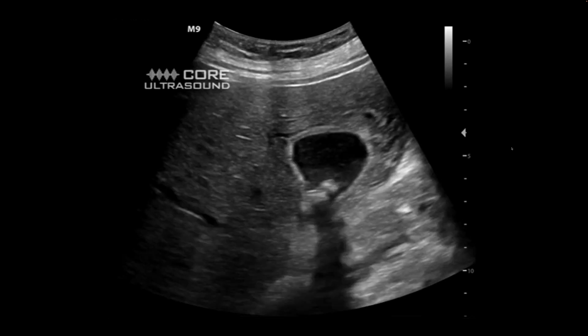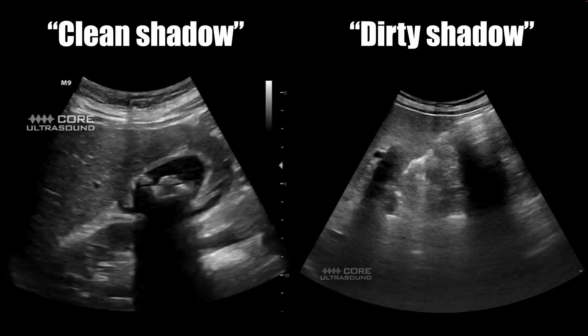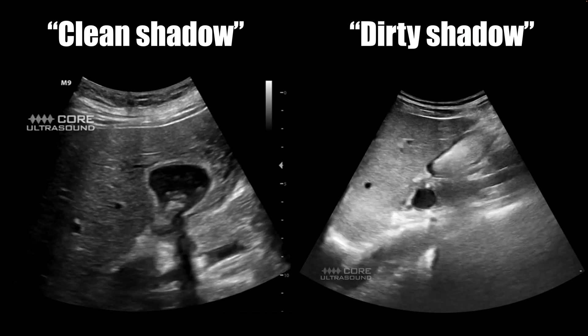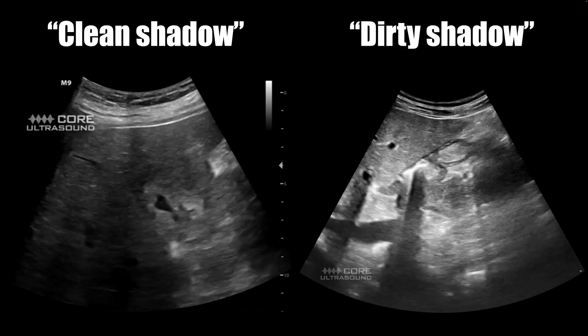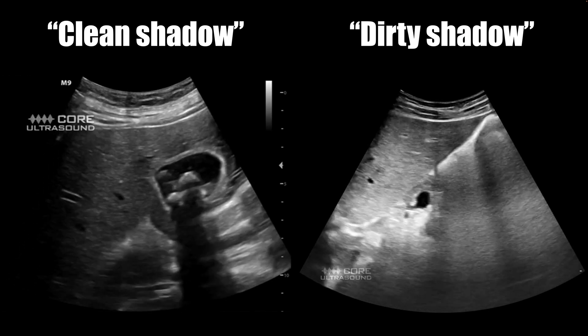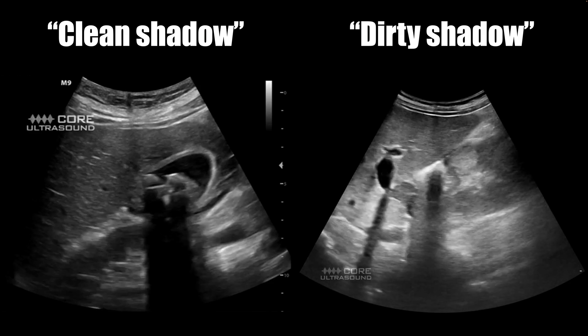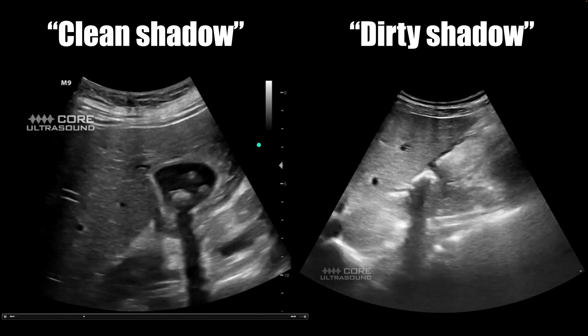There are two different kinds of shadowing. You'll get what I call a clean shadow deep to gallstones, kidney stones, and bones. You'll also get a different type of shadow called a dirty shadow.